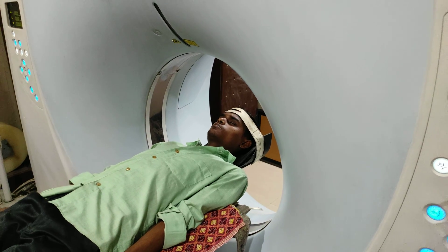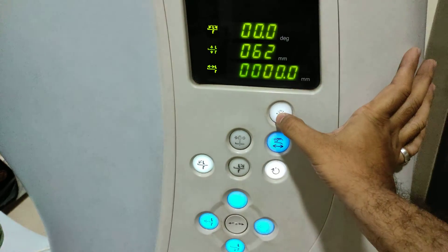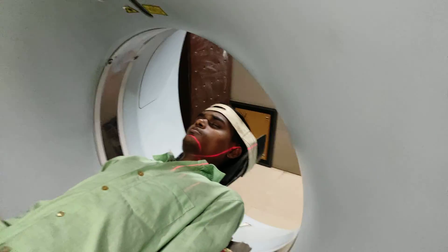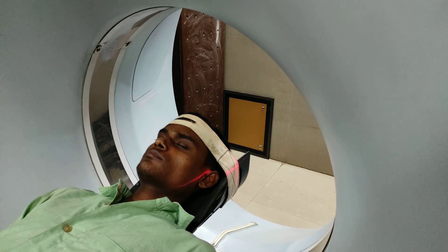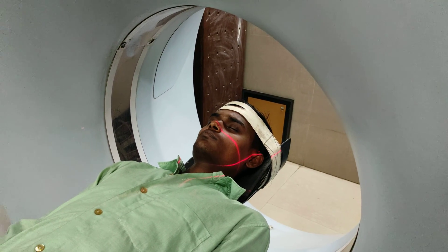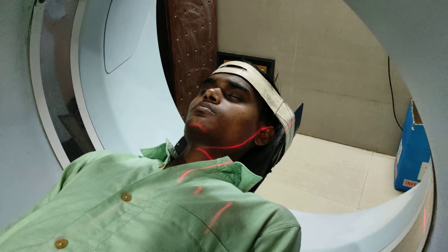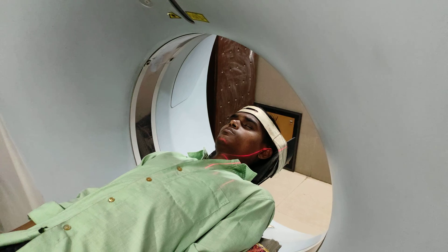Now I will show you how to landmark the patient and how to do positioning. First of all, you have to use the indicator light — you can set it in or out from the system. In my case, I have set the protocol so the scanner will come to our position. You have to landmark at the mandible, right here — landmark at the mandible.